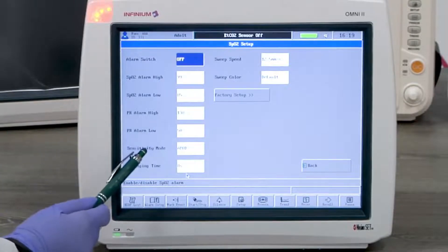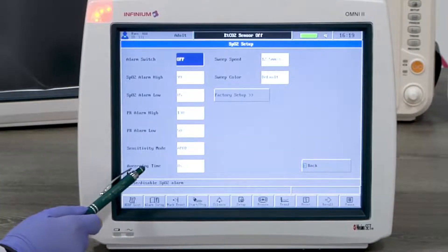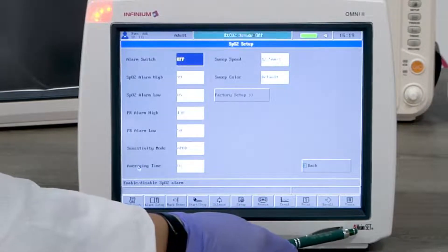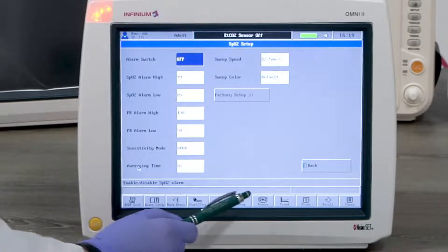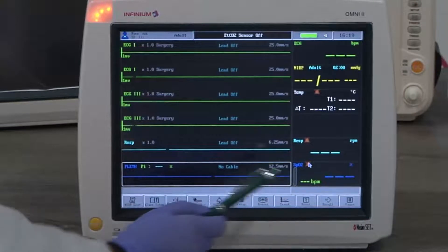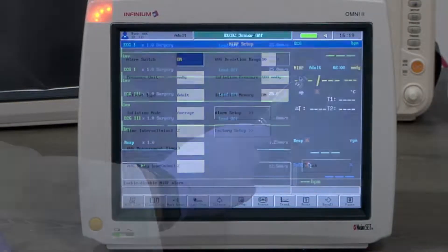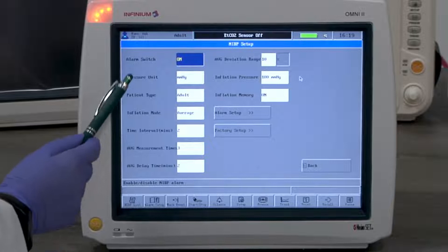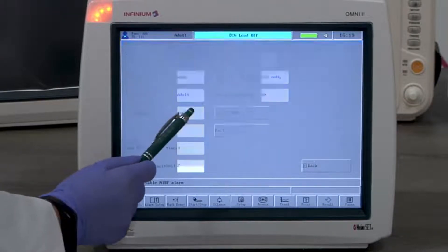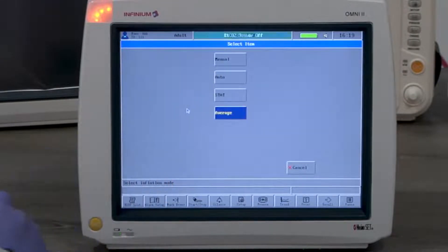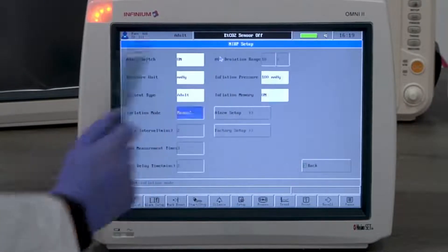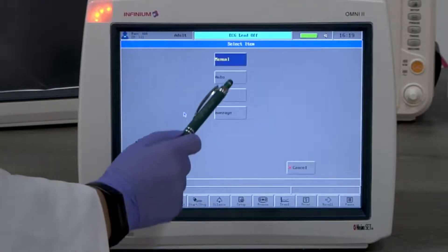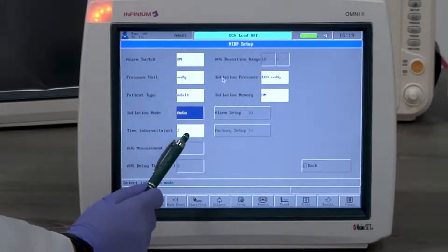Let's look at NIBP monitoring. By tapping on the NIBP window, you will enter the NIBP menu. Here you can change all available settings to fit your needs. We have four inflation modes to select. Manual mode only measures when you give a command. Auto mode measures automatically according to the set interval.